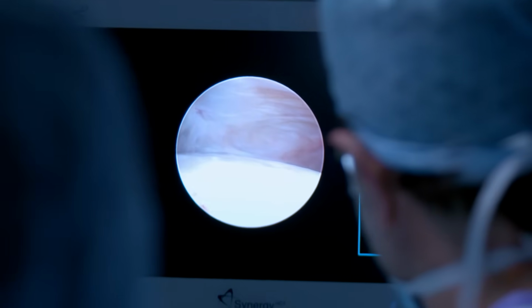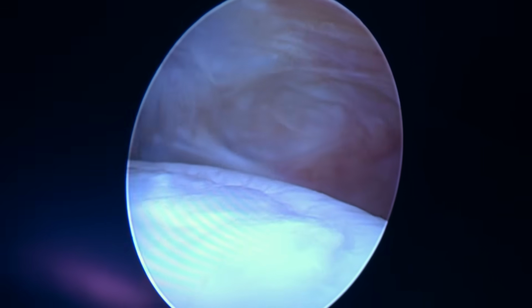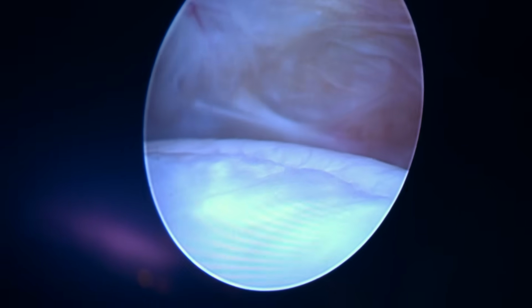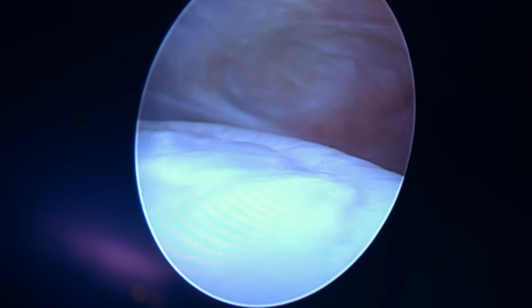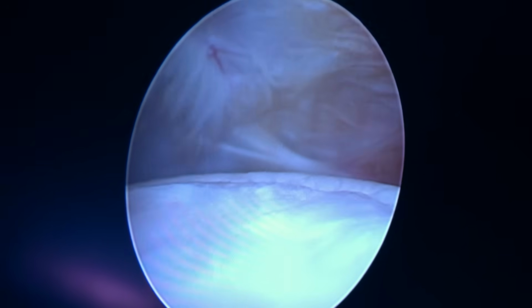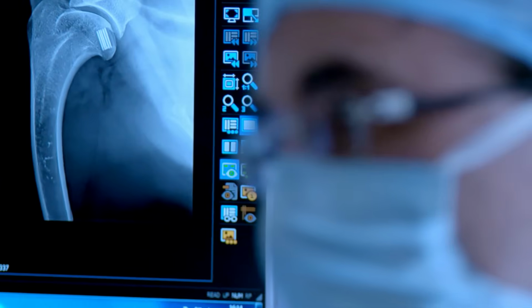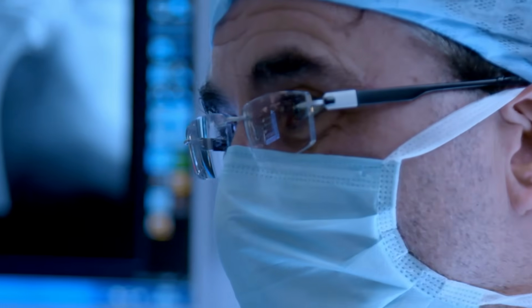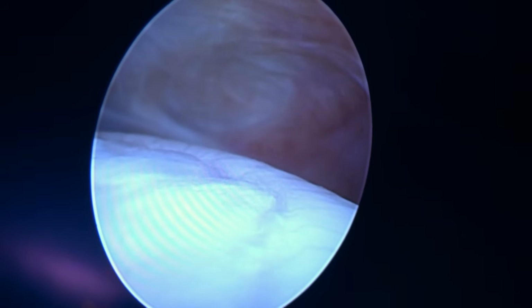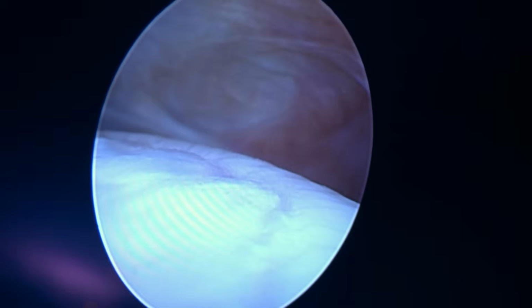Oh, that back edge is beautiful right there. Look at that. If you look down the back there, you'll see that in the foreground, that's where the graft is, and in the background is where the parent cartilage is. It's not perfectly smooth, but then it's never going to be perfectly smooth. But what you're looking for, there's no big hole there. Wow, big sigh of relief all around. Regenerative medicine is the future, my friends.